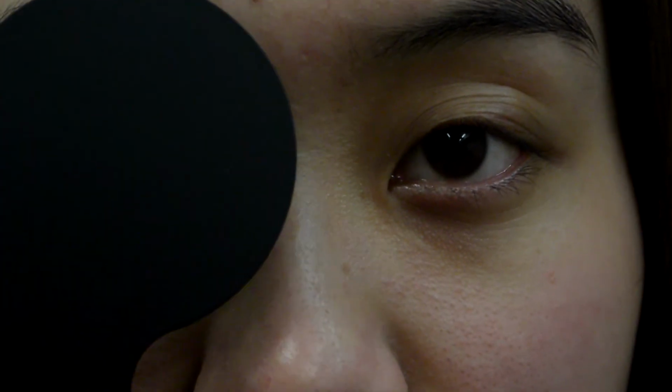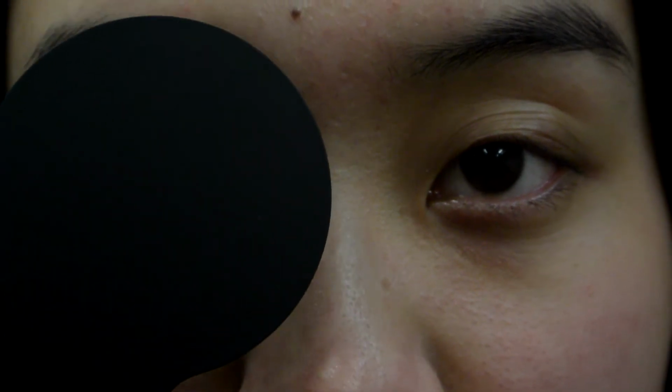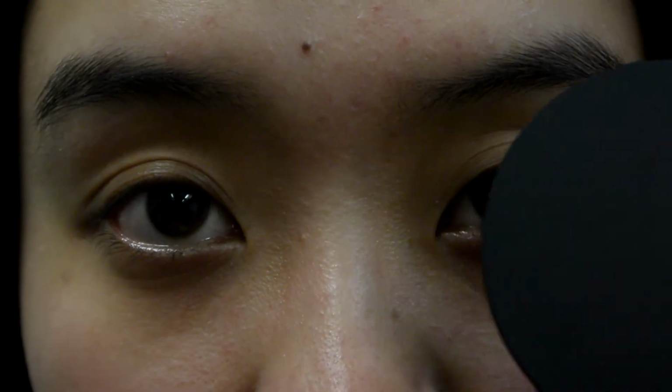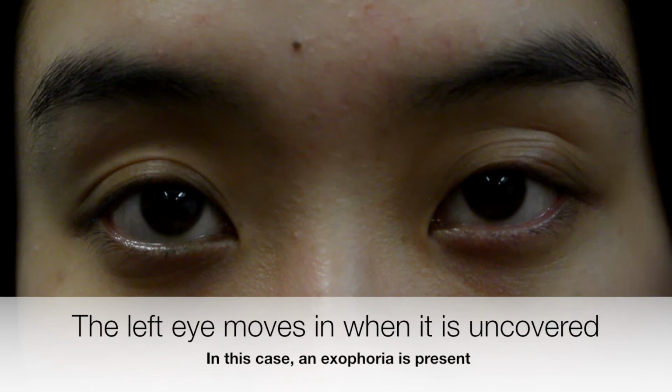This patient has a latent deviation that can be classified as an exophoria. This means that the eye will drift outwards under the cover. Therefore, when the cover is removed in the uncover component of the cover test, we see an inward movement of the eye to regain fixation. Here we see the right eye move in when it is uncovered. When the left eye is uncovered, it also moves inwards.